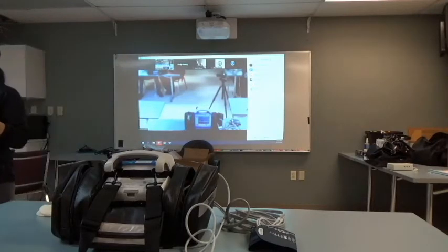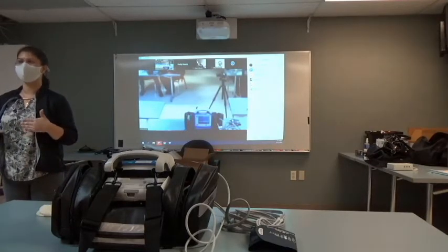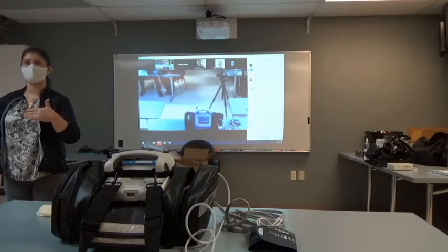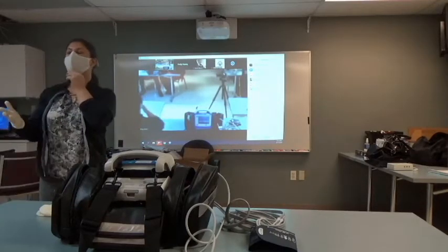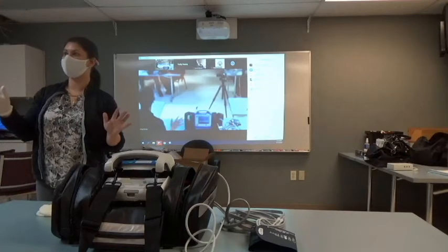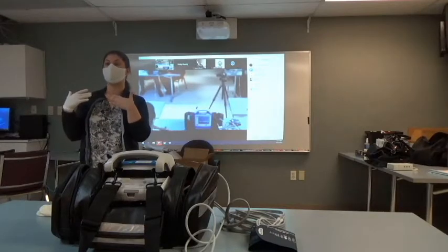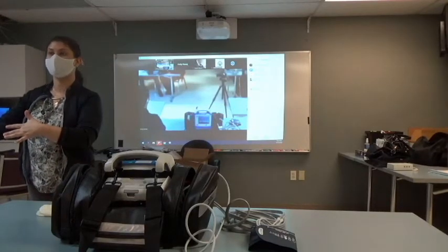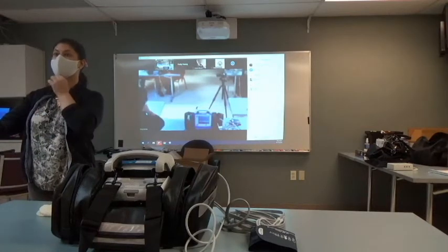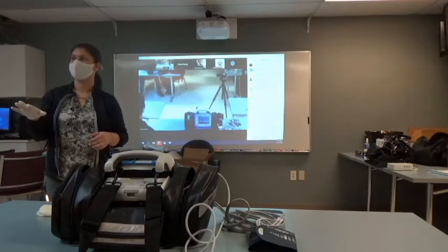Do you guys have a need to put multiple leads on your device? Like for instance, where I work in my city, I have to do an asystole protocol where I have to confirm in two or more leads. Do you guys have anything like that to where you would need to add leads? I'm not sure I understand what you mean by the question. So we can add multiple leads on the device. Do you guys do anything like that? For screen viewing, you mean? For screen viewing or for like me, if I have a patient who's dead on arrival and I need to confirm in two or more leads for asystole, I have to add two leads. Do you guys have anything like that here? No? Not for asystole.